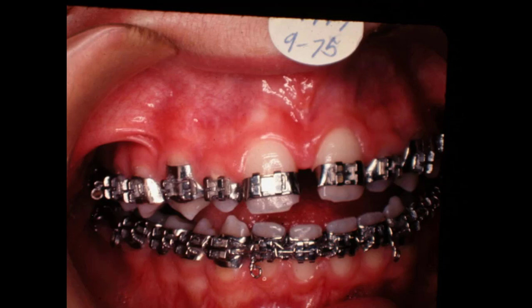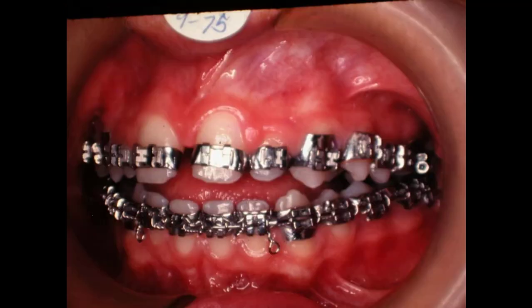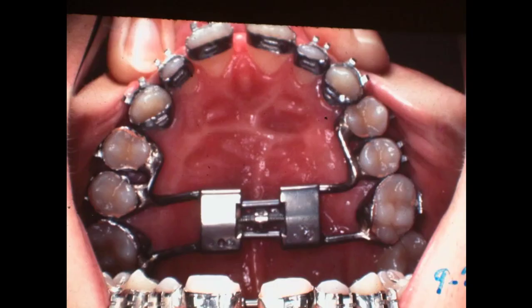Apparently we did come in and put another one and we widened it up even further, and then we'll bring it together up here. This is 9 of 75. And that still is open. Now this one — we cranked it out as far as it would go, and it's wider.